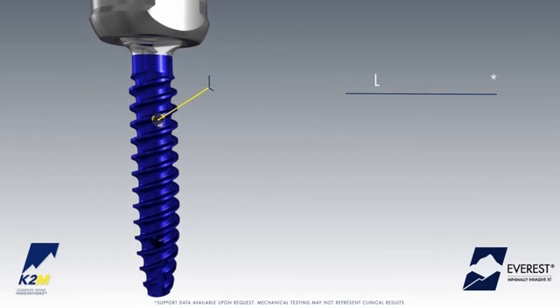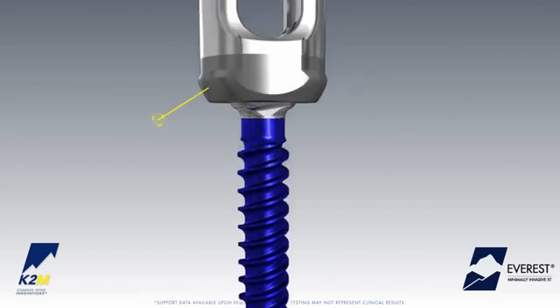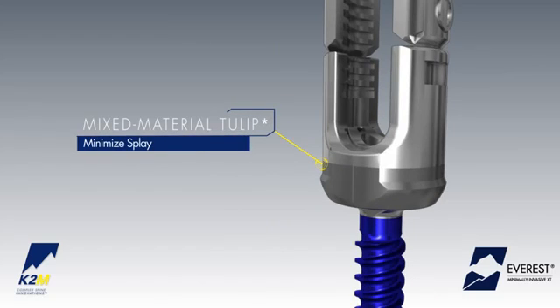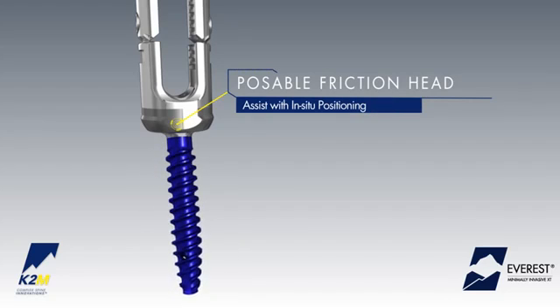These features and benefits include an enhanced dual lead thread pattern, allowing for quick insertion and demonstrated pullout strength, a mixed material tulip designed to minimize splay in the tulip head and improve mechanical performance, and a posable friction head to assist with in-situ positioning of the screw.